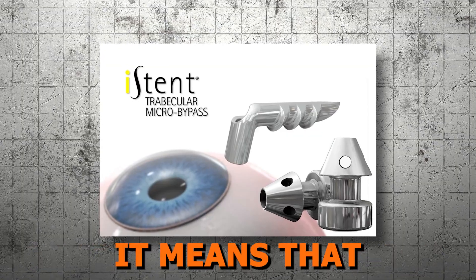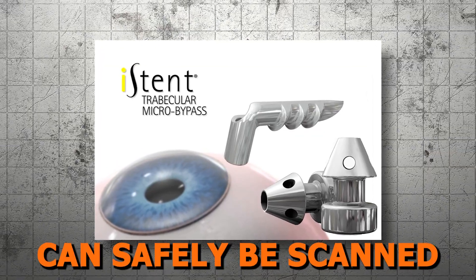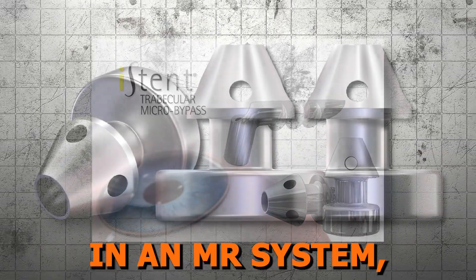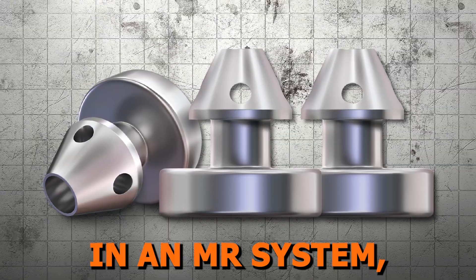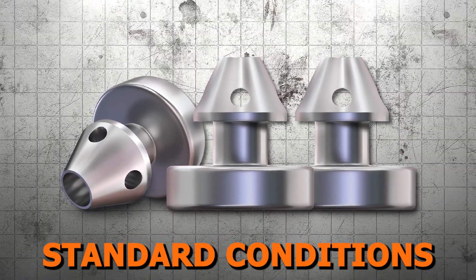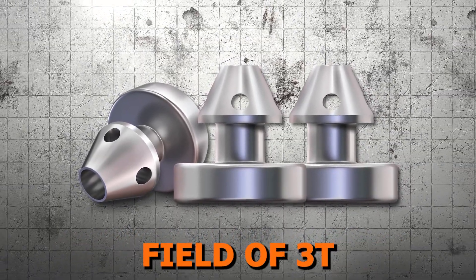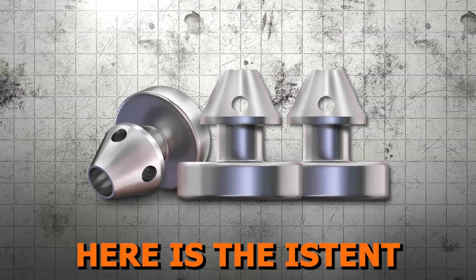What does MR conditional mean? It means that a patient with this device can safely be scanned in an MR system meeting usual standard conditions of a static magnetic field of 3T or less. Here is the iStent in surgical action.